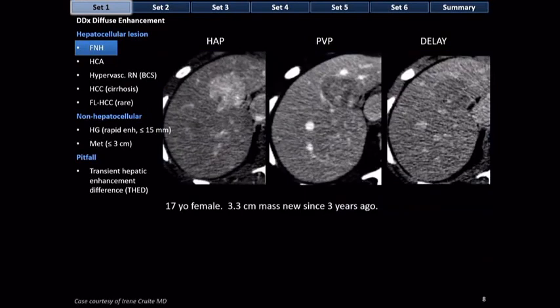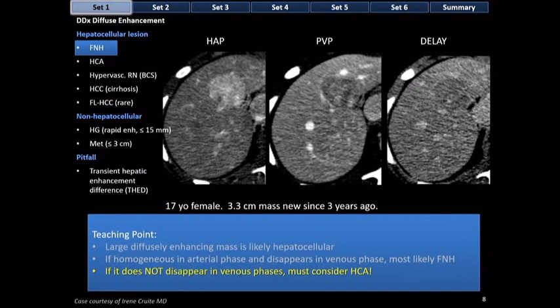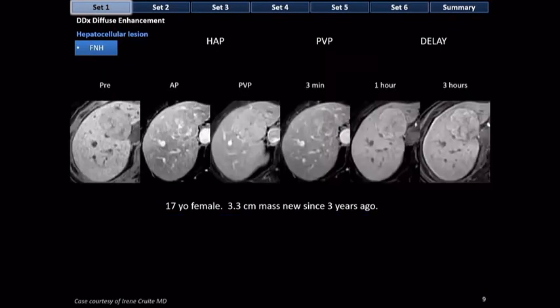Here is a lesion with fairly homogeneous enhancement in the arterial phase, but it does not disappear in the portal venous or delayed phase. It washes out to become darker than the liver, and it's heterogeneous in the venous and delayed phases. You would not call this an FNH and would need additional workup. The patient came back for MRI with a hepatobiliary agent, and at three hours after gadolinium-BOPTA administration, the lesion diffusely takes up the agent — confirming focal nodular hyperplasia.